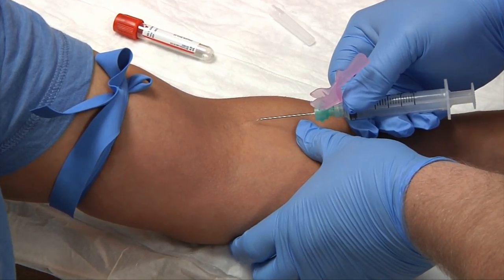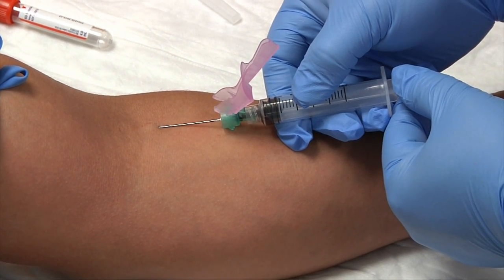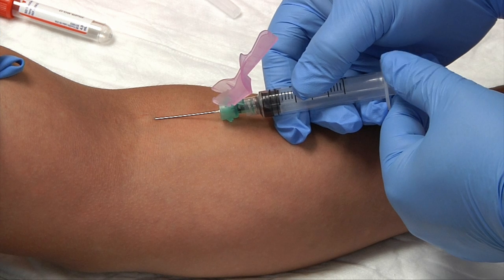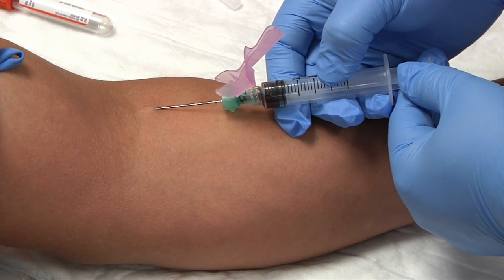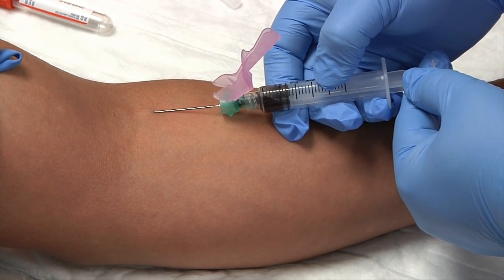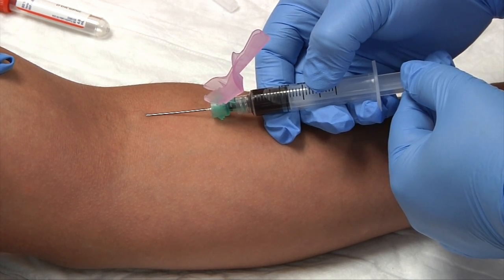Anchor the vein, and one, two, stick. Slowly pull back. For this serum test I'll need three milliliters of blood, so very slowly pull back the plunger until you have three milliliters. The syringe is a graduated cylinder, marked on the side, so you can see the blood slowly move in. It's important to go very slowly — pulling the plunger back too fast can hemolize your specimen.